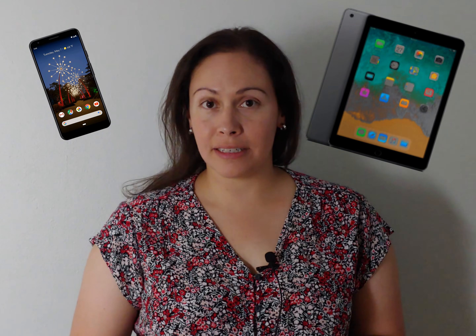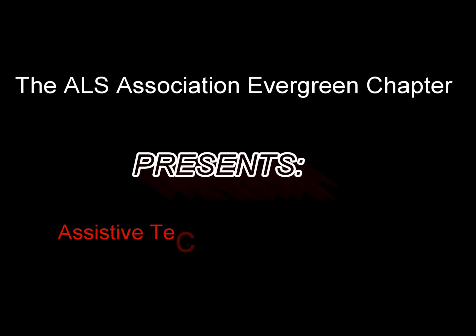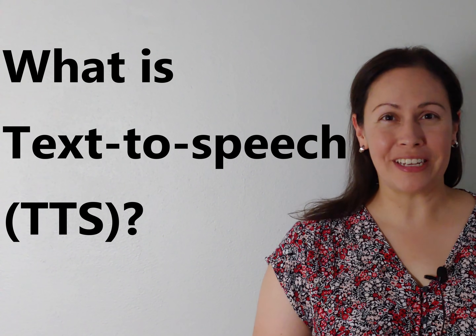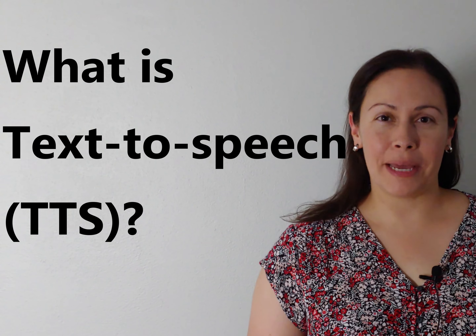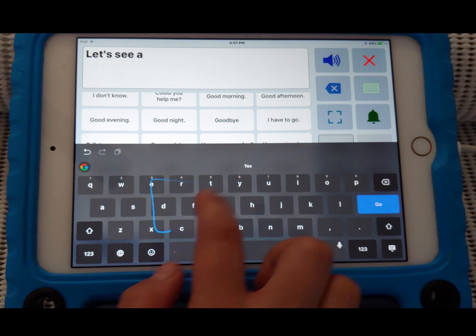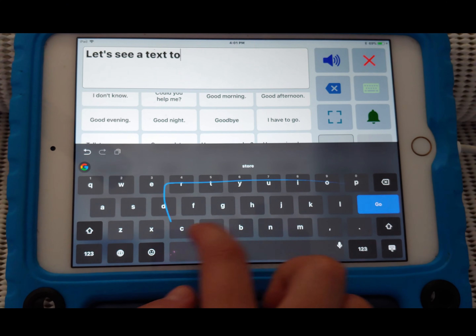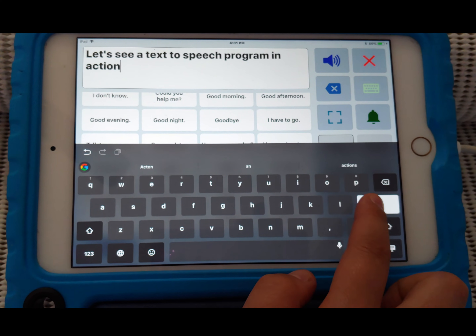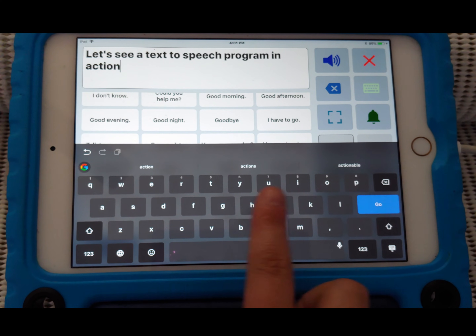Today I'll be showing you how you can communicate using a text-to-speech program on a mobile device. Text-to-speech is basically what it sounds like — you type text out on a program or application, and when you're ready to speak, you press a button and it gets played aloud. Let's see a text-to-speech program in action.